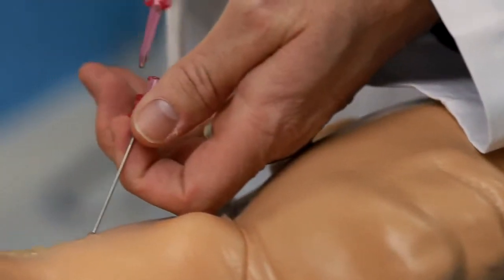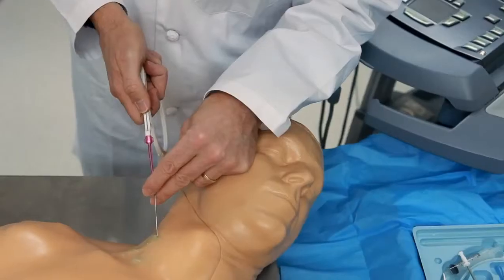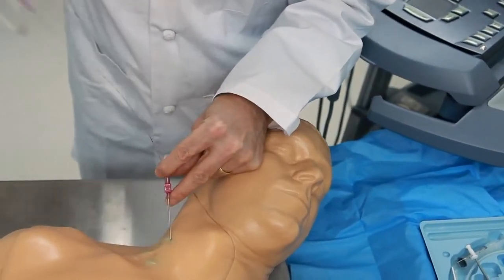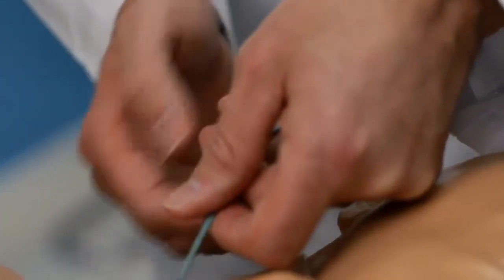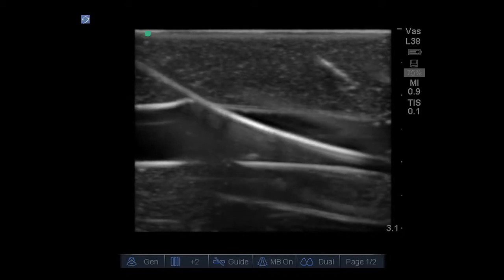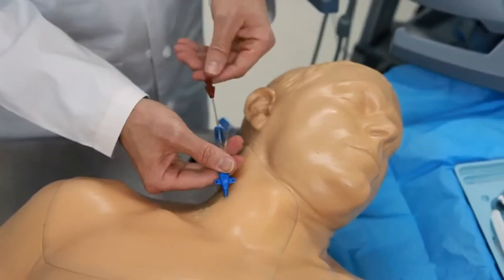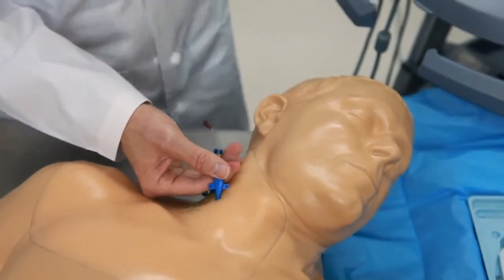Some of the best feedback we get from our customers is how durable our products are — they're always amazed with how many uses they can get out of our tissue. We introduced our central line models in 2003, almost nine years ago, and we're still hearing from customers who are using them today, despite being used thousands of times to place needles, guide wires, and catheters. There's no other material anywhere that comes close to matching our durability.